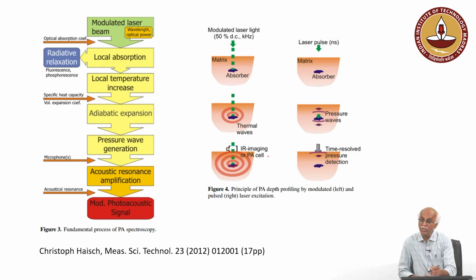However, a photoacoustic cell can capture the photoacoustic signal, which is much better in terms of less scattering due to tissue samples, etc., and it can be efficiently captured. Now, if we try to image this from different positions, we will be able to capture the location as well as various other features surrounding those tissues.